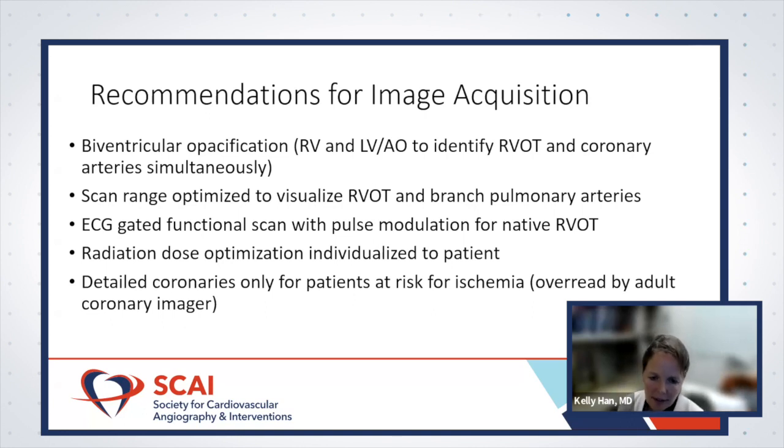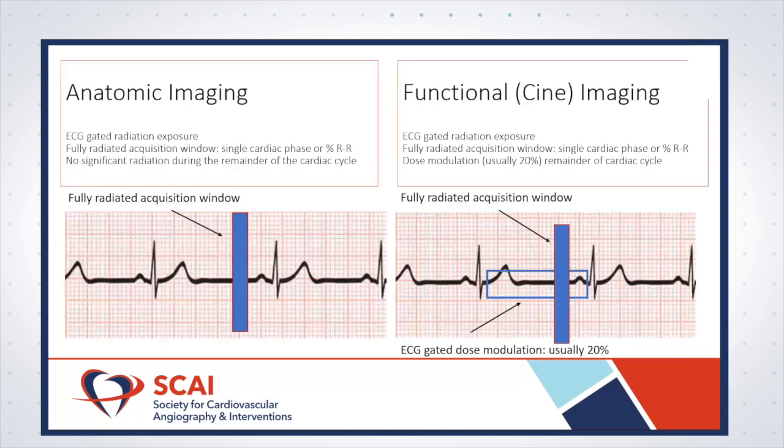And so you can do a very narrow acquisition window and get very low dose scans, particularly on pediatric patients where you don't need detailed coronaries. And so this is just an example of what we're talking about.